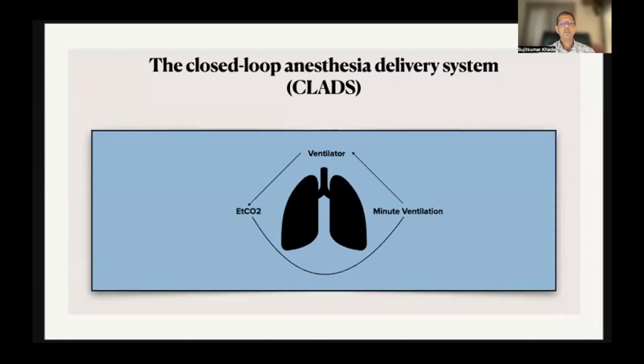If intraoperatively, the anesthesiologist wants to take action based on data, in this case, end-tidal carbon dioxide, and make changes in minute ventilation, this loop will get disengaged. This is just like cruise control. If you adjust speed or gear of the car manually, then cruise control mode will be turned off.